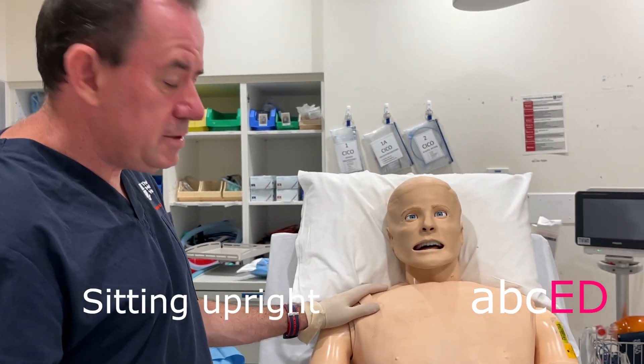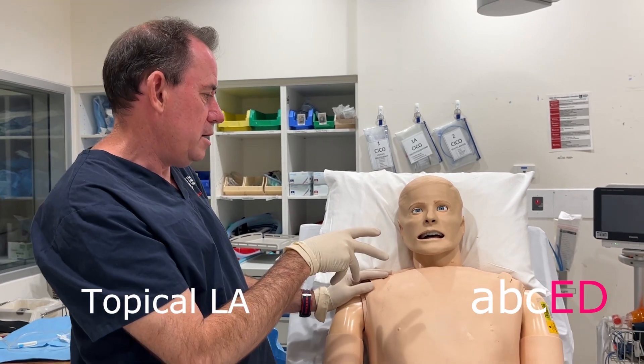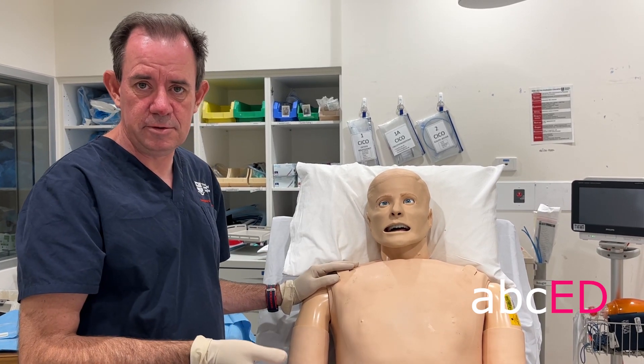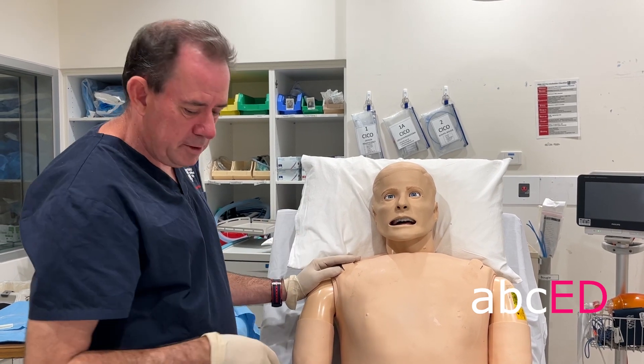Have your patient sitting upright, have them well anaesthetised in both nostrils — we use a cophenolcane spray, but any kind of spray will work. You can even nebulise lignocaine five minutes before you do the procedure, just so that the nose and mouth are completely numb.